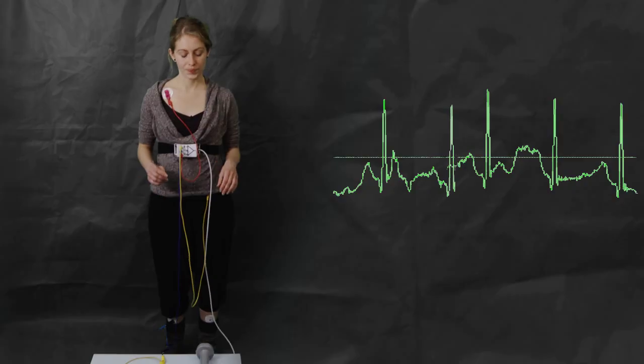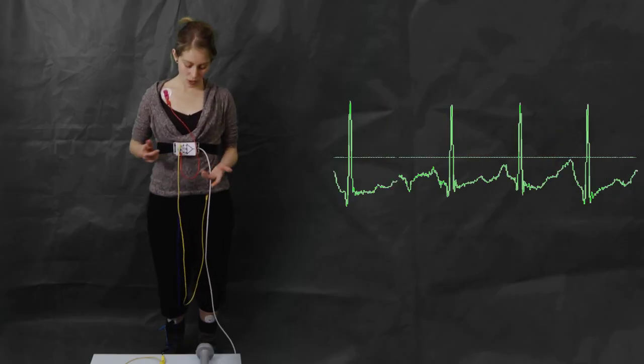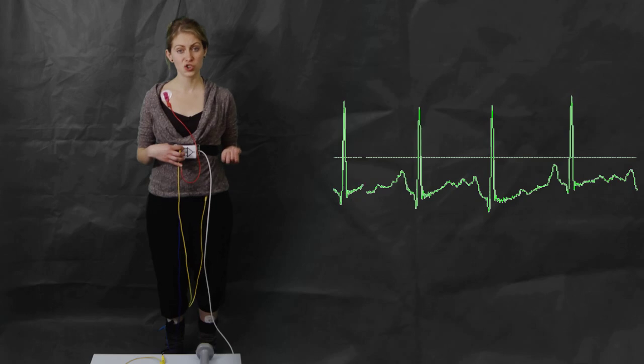But if I start moving my body just a little bit, I see that there are some new artifacts generated on the screen. So where are these artifacts coming from? Well, they're actually coming from cable movement. So even the slightest movement here will affect our recording and will produce some noise. First way, quite easy, is to simply use a shorter cable.